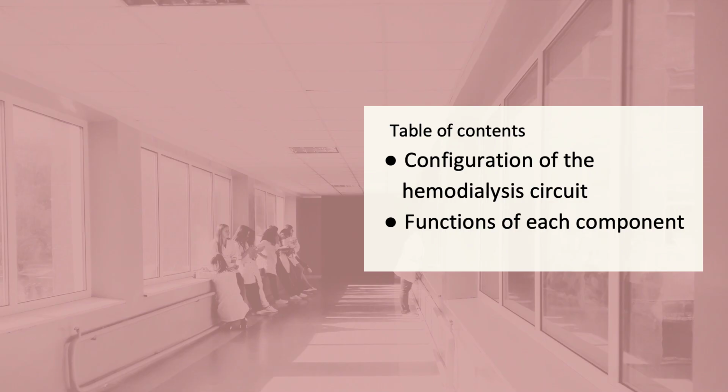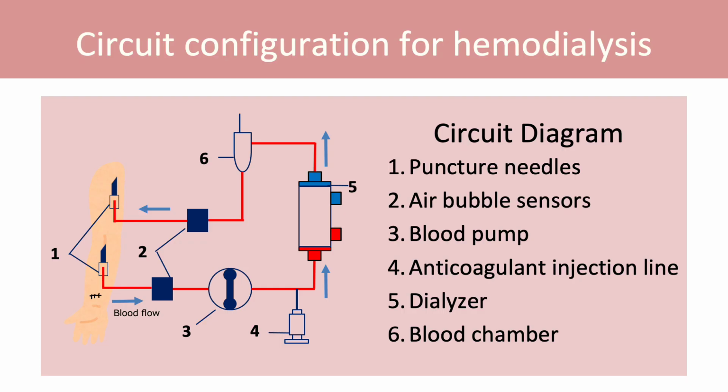This is the content of this lesson. These are the components of a hemodialysis circuit. We will go over the functions of each component one by one.